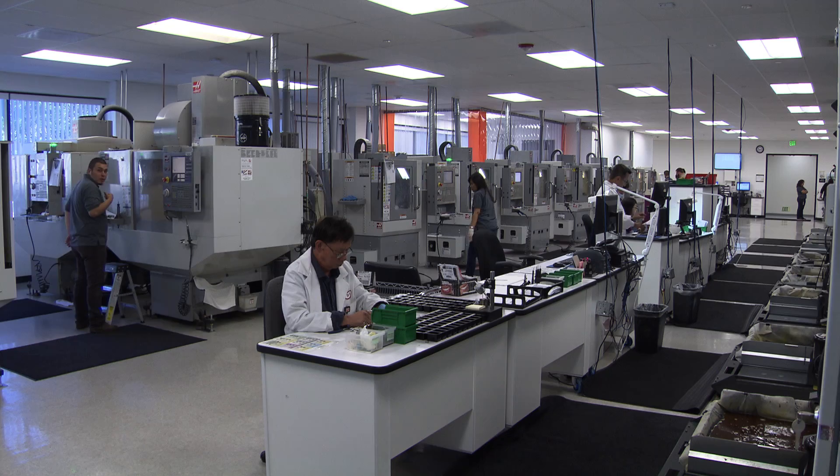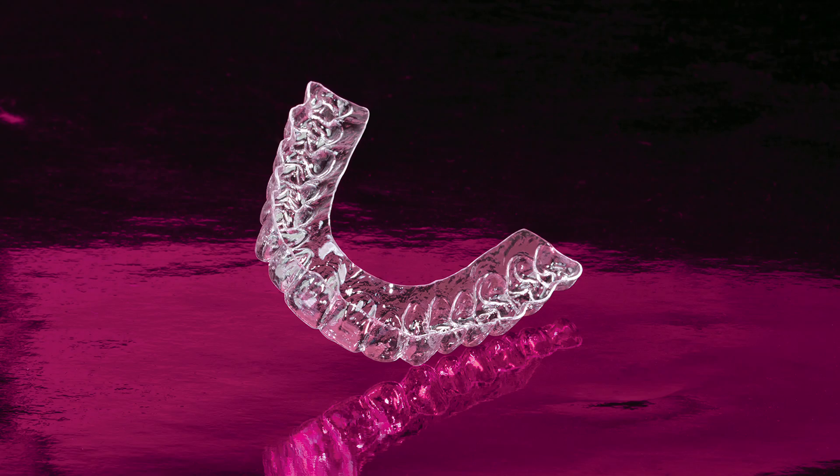Joining the world of digital dentistry can be daunting, but laboratories wanting to ease into the digital realm don't have to jump into the deep end with a massive workflow overhaul. Going digital can be as simple as adding a digital component to an existing service such as thermoformed retainers.